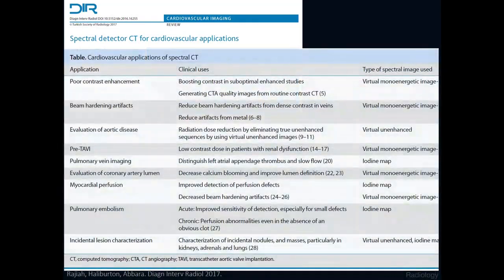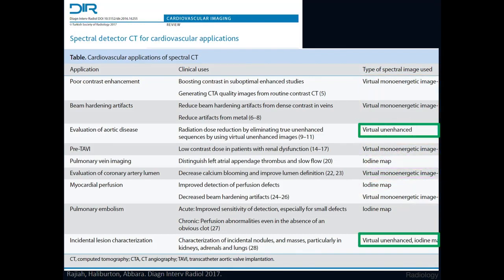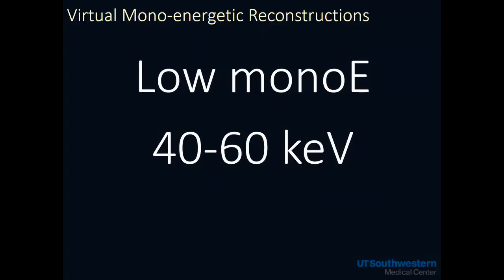And what is that good for in cardiac CT? Well, you can use the various things. This is just to show the potential clinical applications, a lot of them use that virtual monoenergetic. Some use the iodine map, and others use the virtual unenhanced images. There's more, but these are perhaps the most common and the more promising ones. So low monoenergetic imaging, what does that mean? It's the lower spectrum of the monoenergetic images where your iodine signal, the Hounsfield units, I should put it in quotation marks, it's not really Hounsfield units anymore, but what you measure, the CT numbers, will be much higher for iodine than they are at 120 kVp.